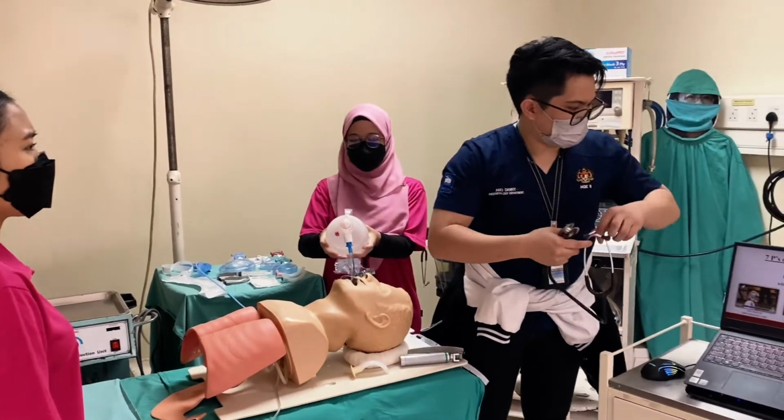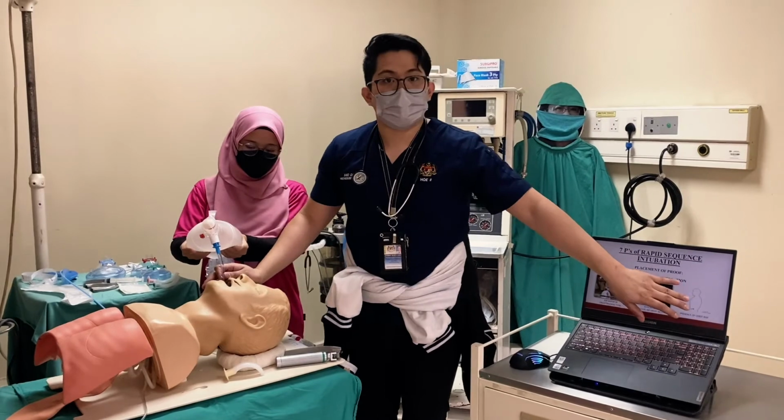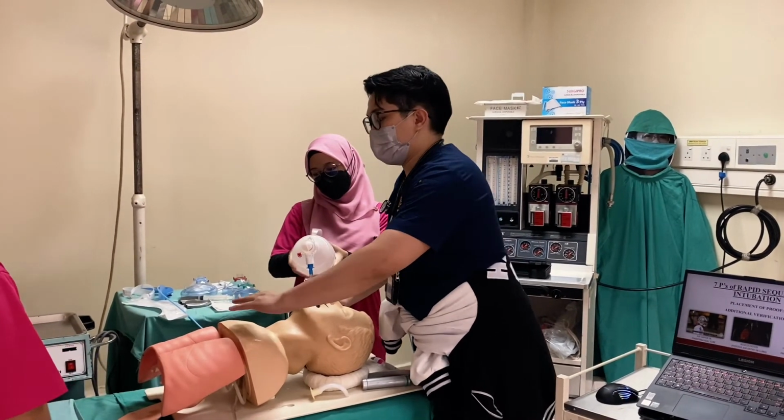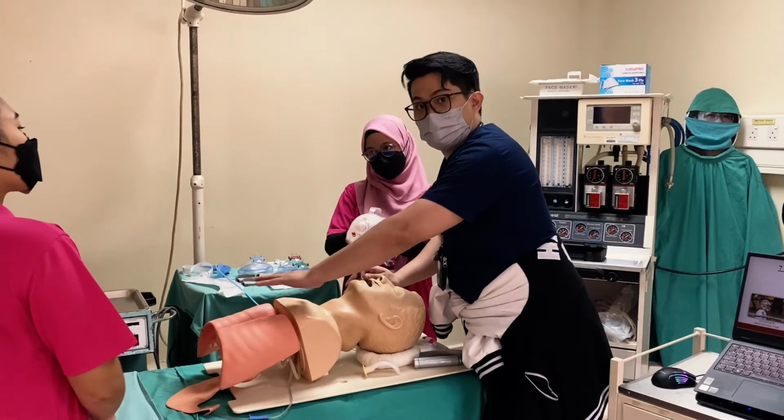In certain cases as well, we can see whether or not our placement is correct with the presence of chest rise. It's not like we can see the lung now or anything, but in a real situation, you will see the patient's chest moving up and down.